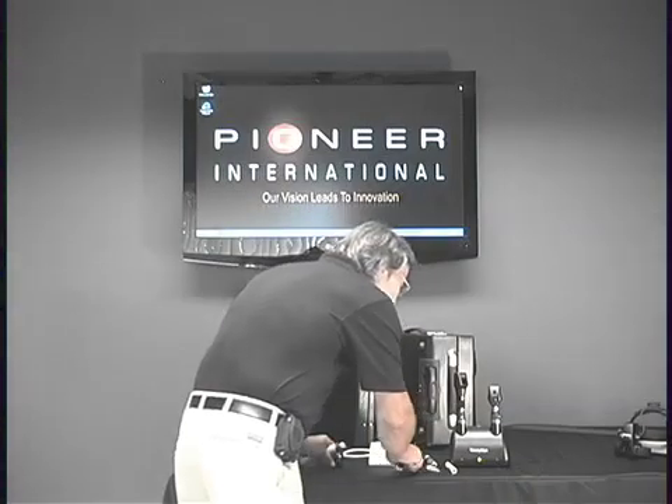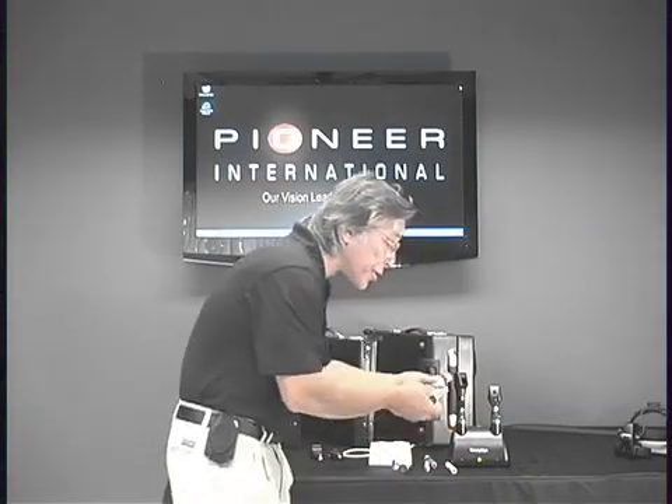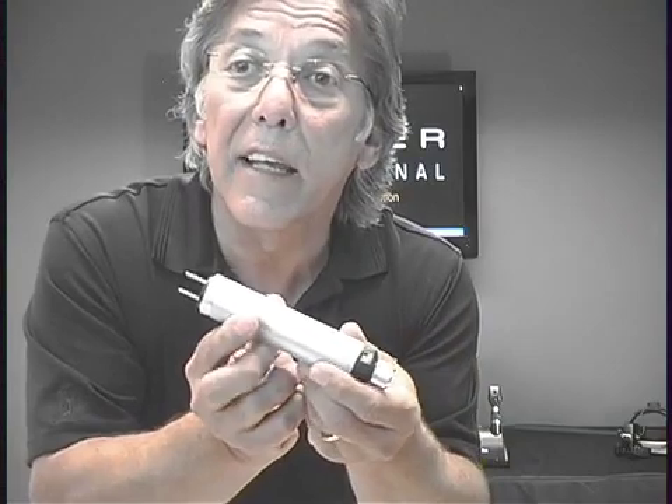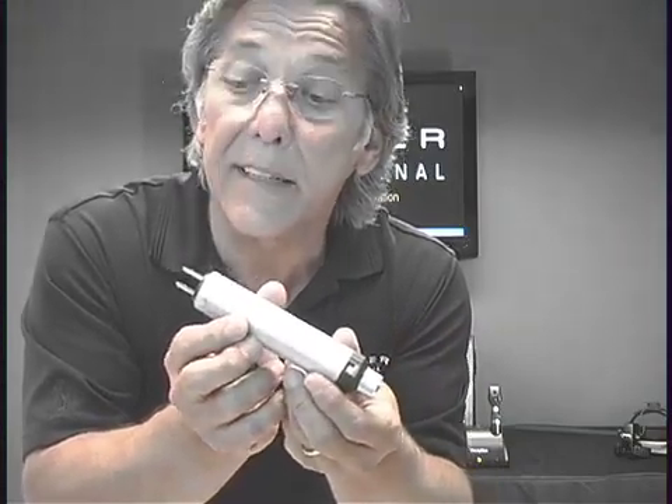There's one more feature to show you on the beta NT — it is an optional feature. This particular one is a wall adapter plug for the bottom of the beta NT handle. If one handle goes dead, you have the option of using this beta NT adapter to charge right in the wall in class or clinic. It's a very nice, useful piece — something to consider when looking at your diagnostic set. It's optional, but well worth having just for emergencies.